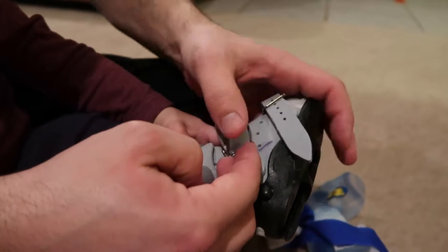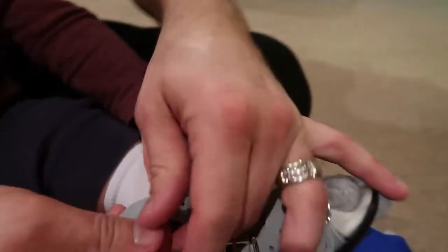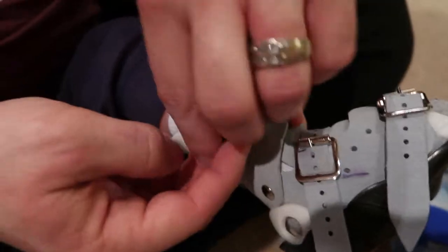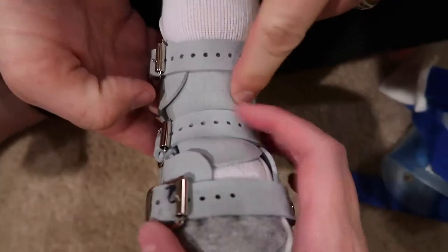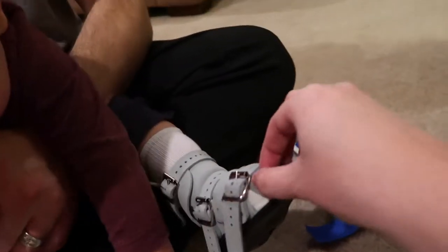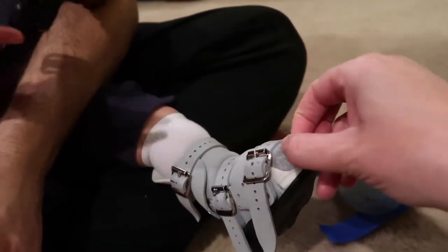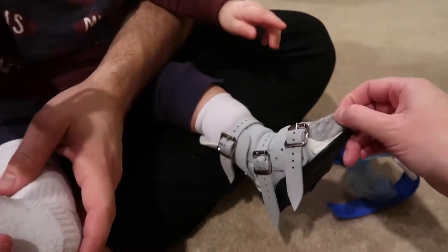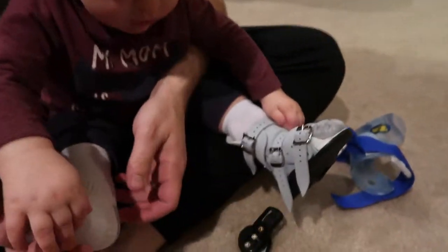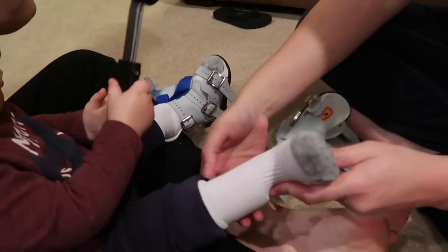Before you buckle, check to make sure everything is down smoothly. A lot of times the tongue of the shoe will bunch up, so you want to make sure it's flat with no spots bunching. Also, once you have it done, give the sock a little pull at the bottom and the top to make sure there are no wrinkles in the sock, because any wrinkle can cause a blister.